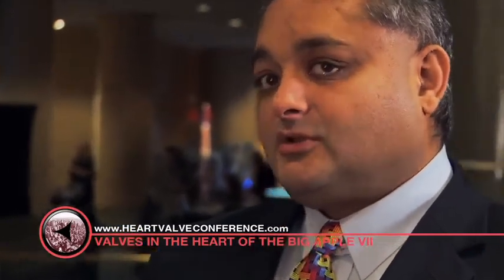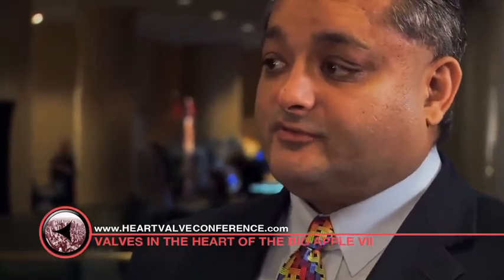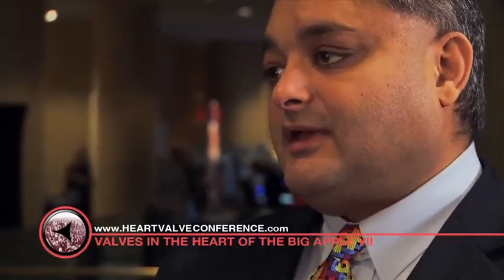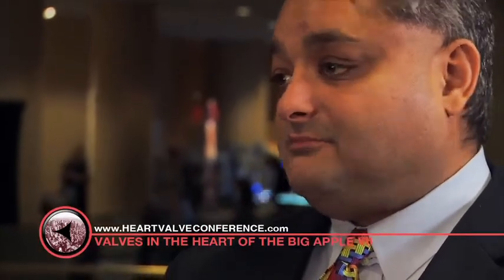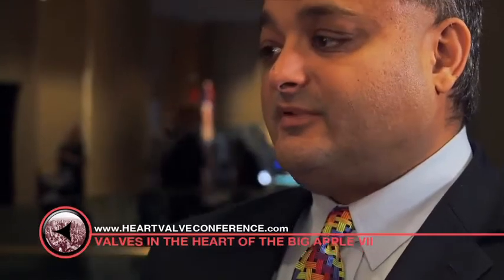Well, I would say sizing of the annulus. Right now we're still a little bit limited in the number of choices of valves and valve sizes we have. Nonetheless, one of the big problems we have is not accurately sizing it. Historically we've always used the 2D echo long axis view, and now we've learned from multimodality imaging that 3D is a better way, that at least a third of the time the annulus is not circular, it's more oval. And to really get a better look at that, 3D is the key, whether it's 3D echo or 3D CT, some kind of imaging ahead of time.